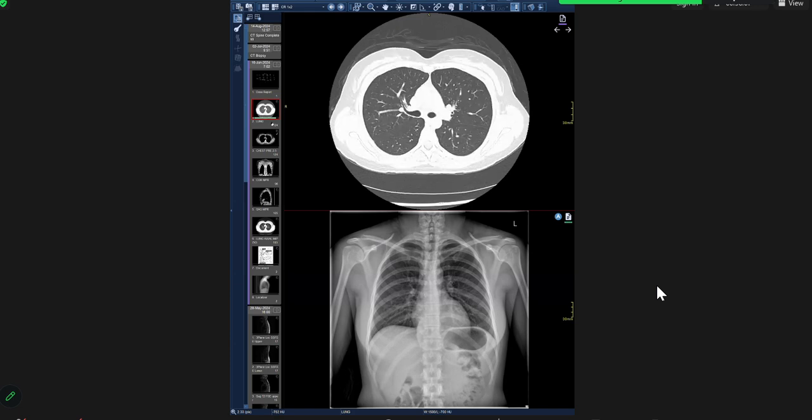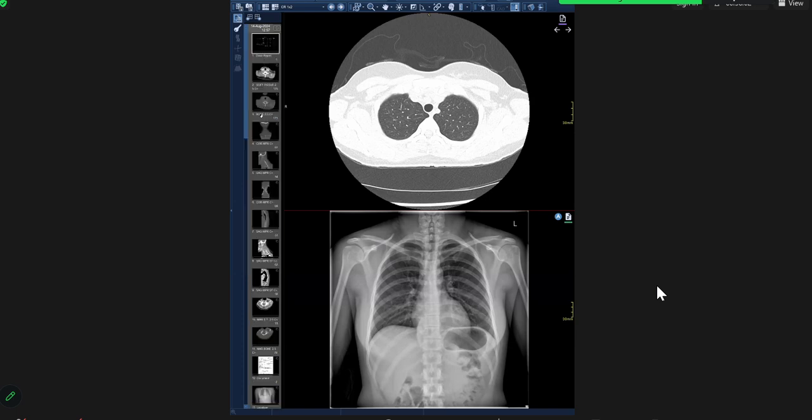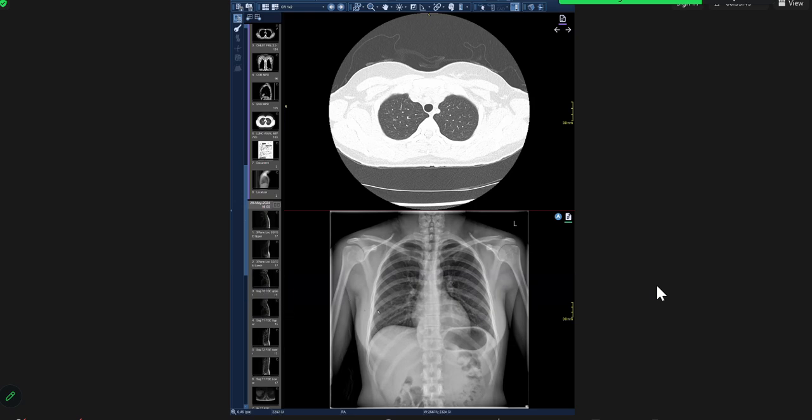So what's your management, which is the most important thing? To drain this abscess and to start the ATT of the patient. Okay, so you did this case well, but from a management point of view, I would say you need a little improvement. Management for TB, for exam purposes, everybody has to be aware of the guidelines. First of all, isolate the patient. Second thing, you don't know if the patient has pulmonary tuberculosis or not, right? You don't know.